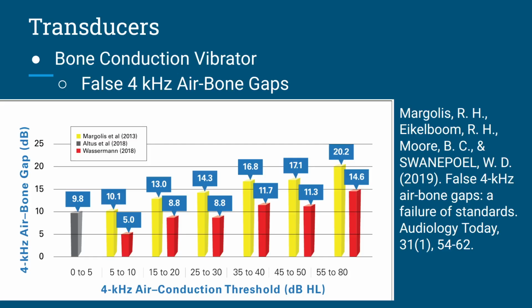And here's a study. This is a little bit easier study to read, from Audiology Today, a trade journal magazine on Blackboard. So the phenomenon here is audiograms for patients with pure sensorineural hearing losses show non-pathologic air-bone gaps between 10 and 20 dB on average, isolated to 4,000 hertz.